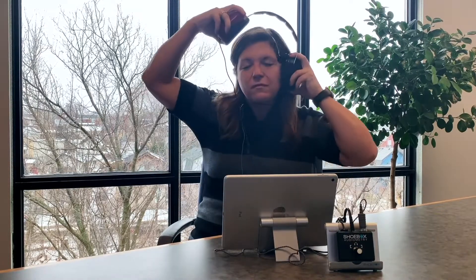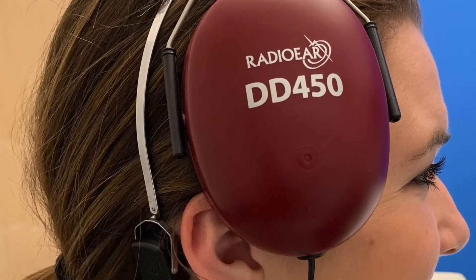For masked bone conduction testing, you will need to introduce your air transducers. I recommend setting them up to the smallest configuration. You'll want to cover the non-test ear because that's where the masking will be presented. You'll want to keep the test ear open and clear, therefore placing the transducer on the forehead or side of the head is the best option.